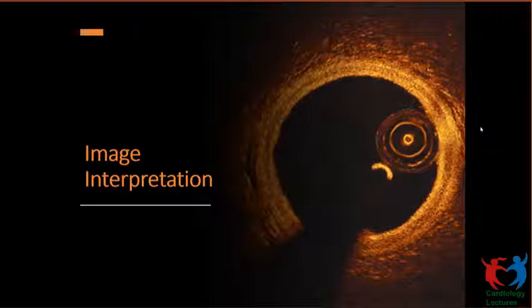This part of the catheter is really soft and has got a 2.7 French profile. It's very small in diameter, so it's not going to damage that part of the vessel. That much I assure you. So it can be there and you can take an image backwards.